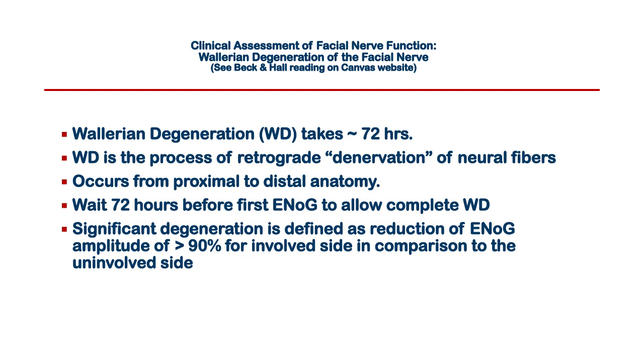And I called, and they said, "We've got a patient with facial paralysis, and it was a trauma, and we need to do an ENoG. Could you come do it?" And I said, "Well, geez, I'm not even in Gainesville. I'm at this meeting wherever I was. We've got somebody that can do it, but when did this happen?" They said, "Well, it's just yesterday." I said, "Well, okay, there's no sense in doing the ENoG for the next 2 to 3 days, because any degeneration is going to take that long to develop. So I'll do this when I get back in the clinic. It'll be just about the right time."